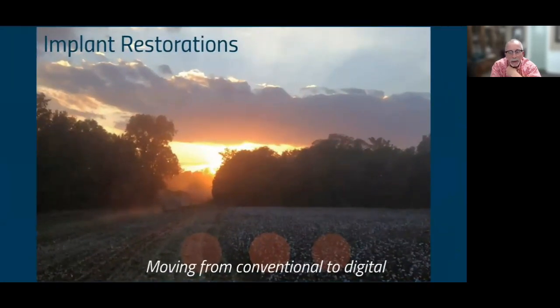Now, moving that to digital, right? And in more of a complete digital workflow, even though a lot of what I described is certainly digital, right? But you may not have ever seen it. You might have taken a traditional impression, sent it to the lab, and the lab would put the scan post in the model, and they would send that scan off to Atlantis to get that abutment made. But we're going to move that more and more into the operatory. And so when we move our implant restorations over to the digital space, what are we talking about?